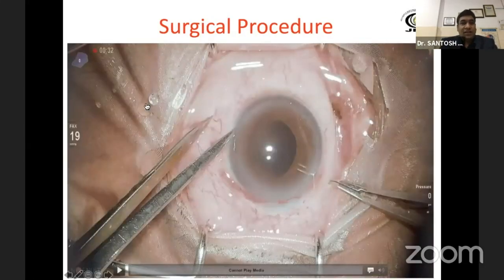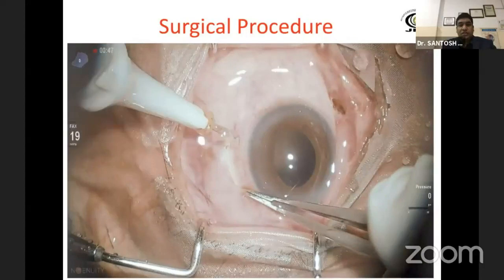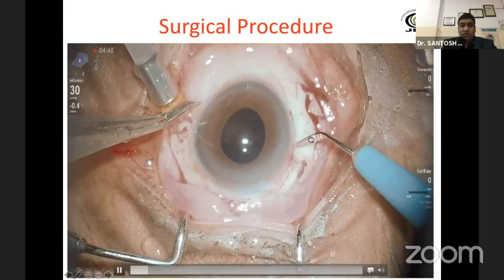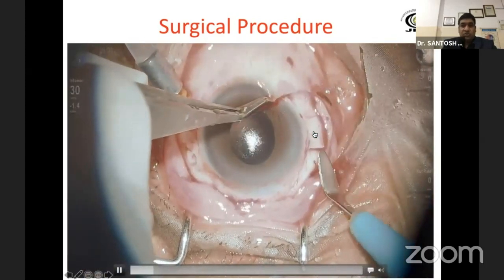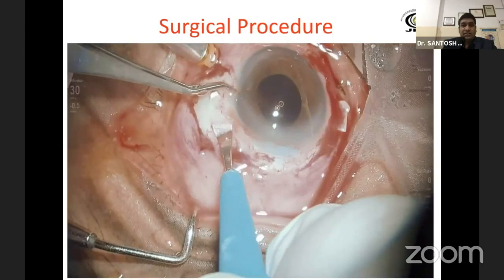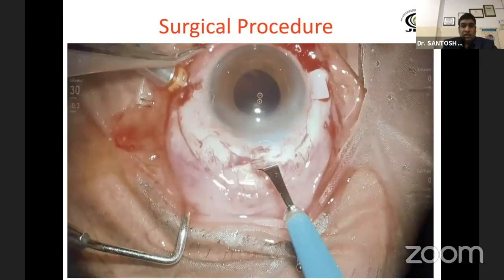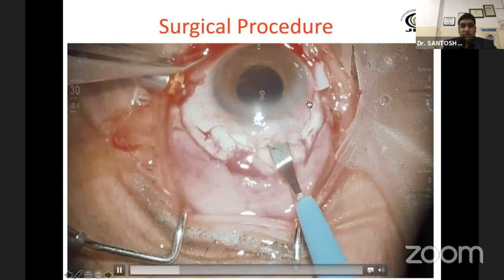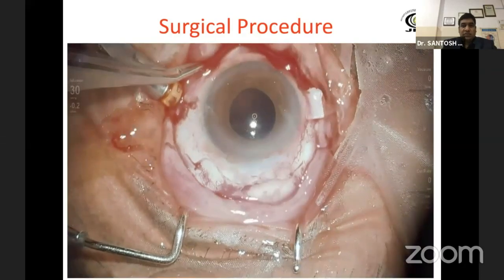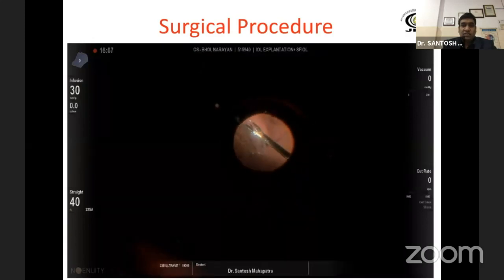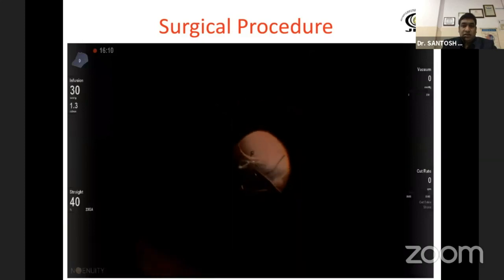Here is the example of a surgical procedure. This is a case of a dislocated IOL into the vitreous cavity. I am making flaps here at 3 and 9 o'clock position with the tunnel blade on both sides. After making flaps, the sclerocorneal tunnel is made at 12 o'clock position. This facilitates both removal of the IOL and insertion of a 3-piece IOL. You can see a foldable IOL is on the retina.